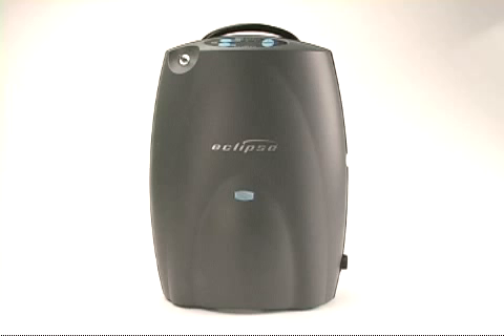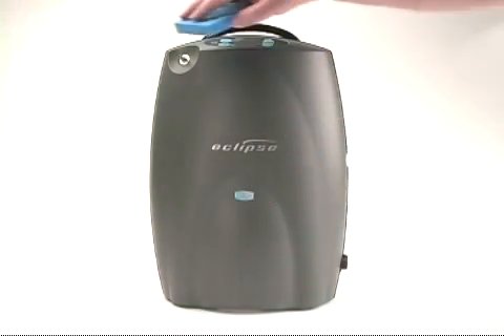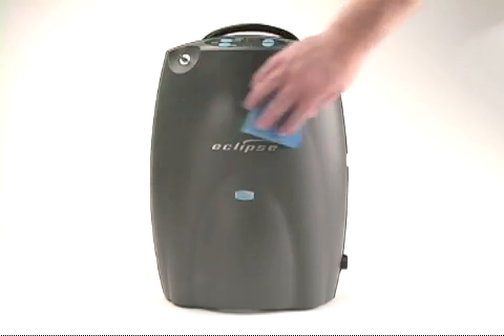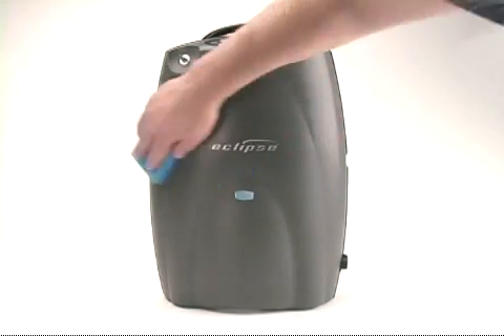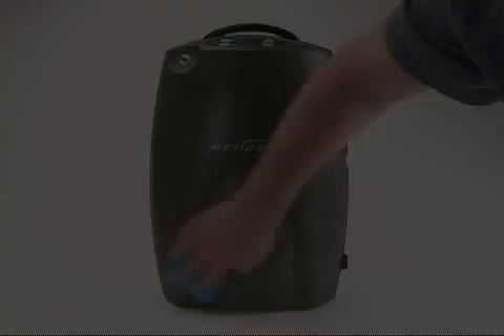To clean the outer cabinet, first turn off the Eclipse II and disconnect any AC or DC power cables. Then spray a mild detergent solution or disinfectant onto a clean damp sponge or cloth, and wipe the outside surfaces of the Eclipse, the power cartridge, the power supplies, and the mobile cart.